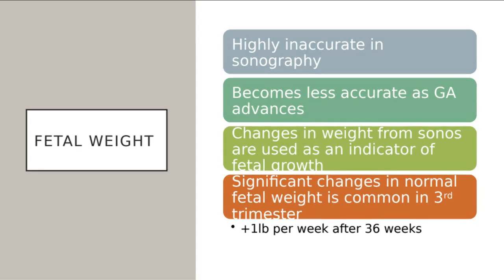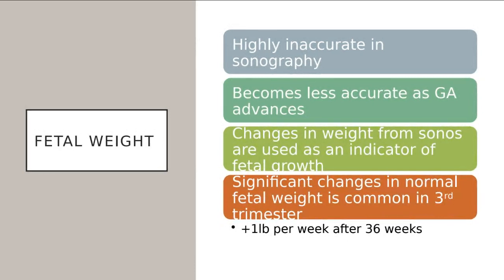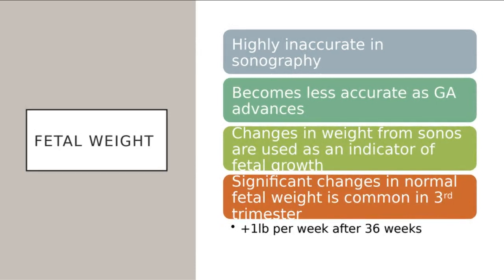So it continues to be a controversy in the OB ultrasound world. Radiologists usually do not even report on the estimated fetal weight because of that. But it is something that our systems calculate based off of all of the measurements that we put in the calc package. Now, we do expect to see significant changes in that baby's weight in the 3rd trimester.